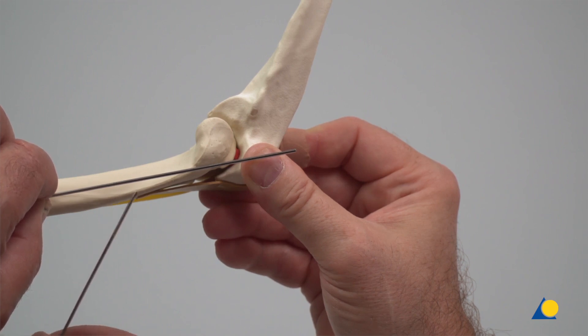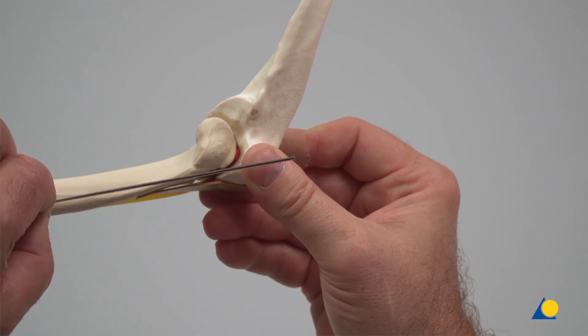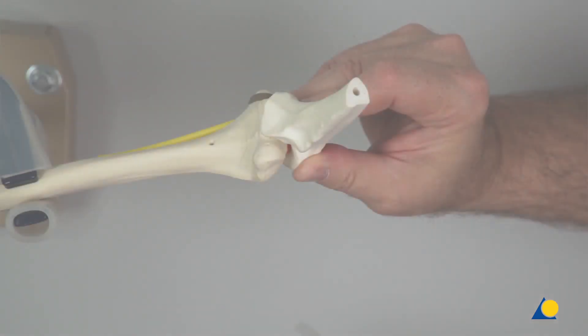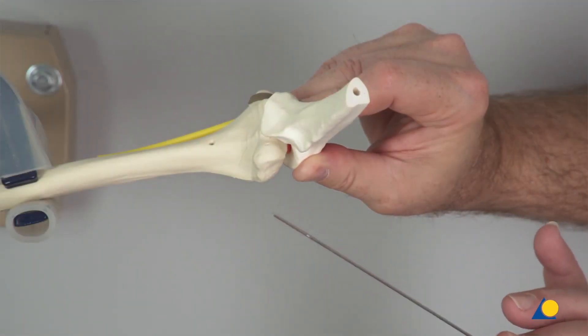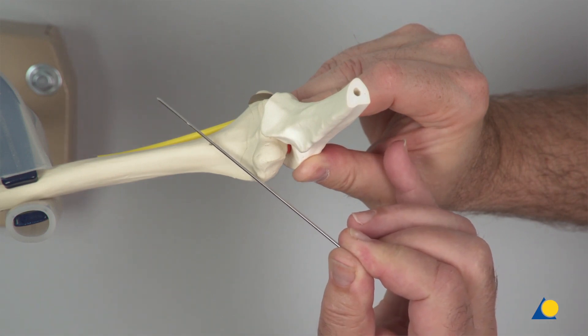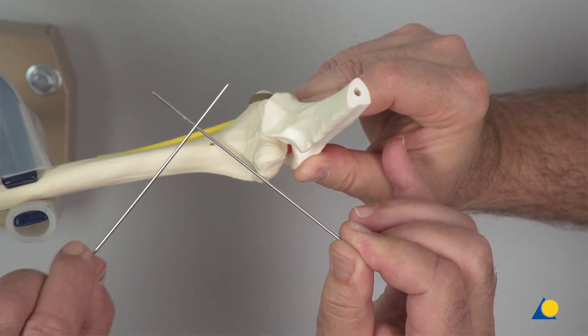Note that the first K-wire insertion must not be aligned to the lateral edge of the humerus as this will result in the K-wire missing contact within the olecranon fossa leading to an unsatisfactory fracture fixation. The crossing of both K-wires must be planned to occur above the fracture and centered within the shaft axis in both the AP and lateral views.